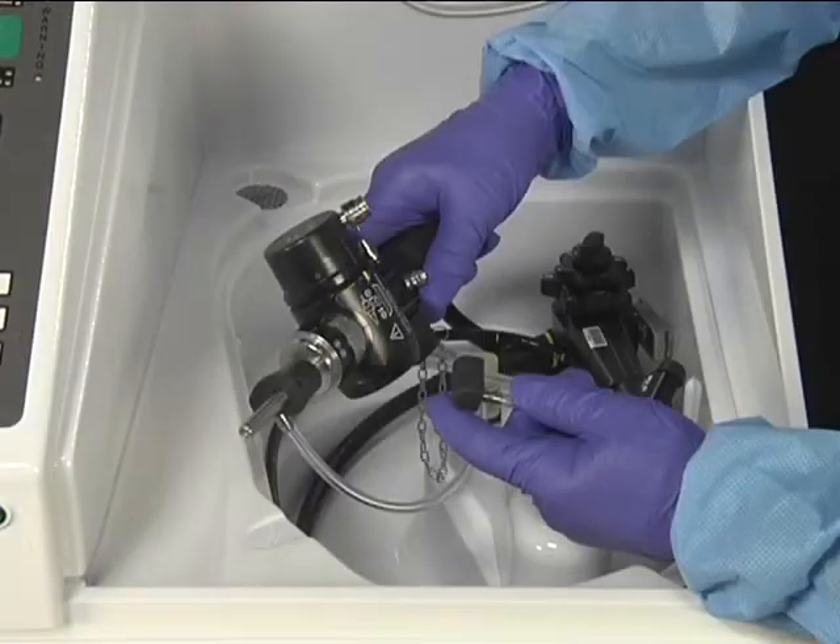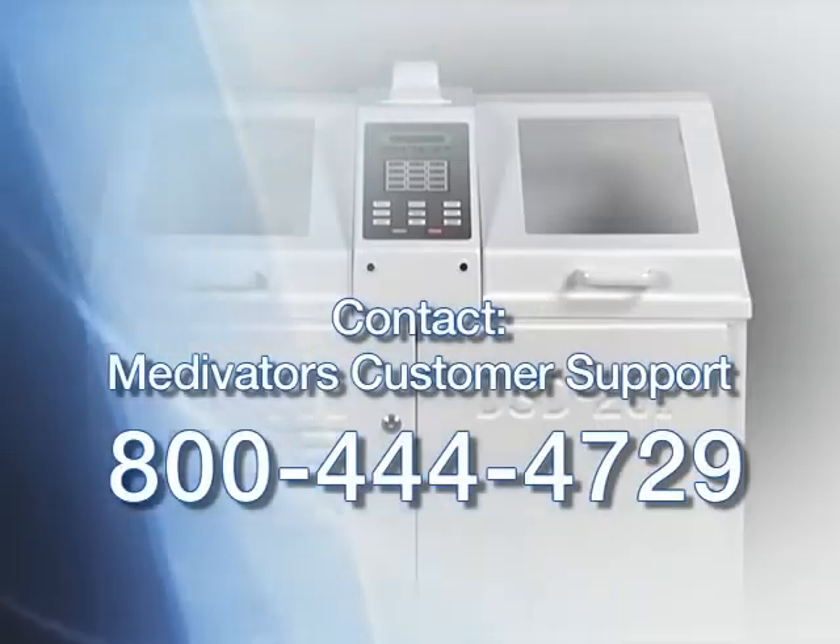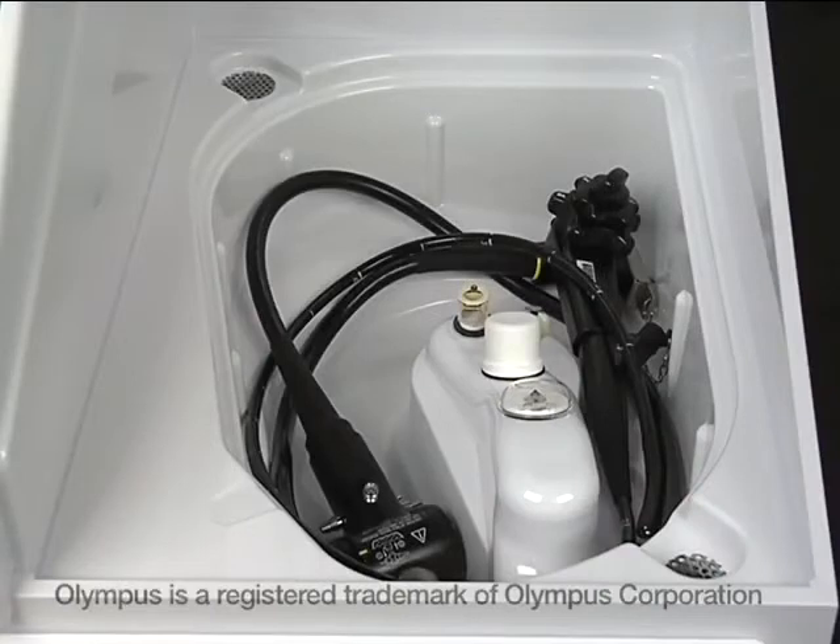Endoscope channel connectors must be purchased along with your DSD-201. Matching the scope to the correct connector is critical to proper reprocessing of the endoscope. If you have any questions regarding DSD-201 connectors for your particular endoscope, contact your Medivators Sales Consultant, Clinical Specialist, or Technical Support before proceeding. We will demonstrate the connection of an Olympus Exera 160 GIF video endoscope to the HU-0069 hookup.